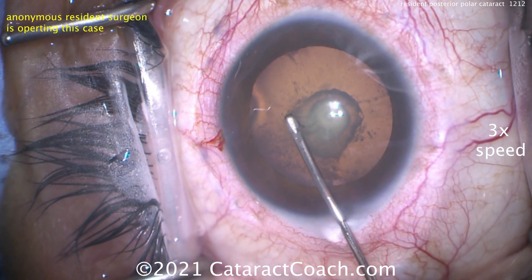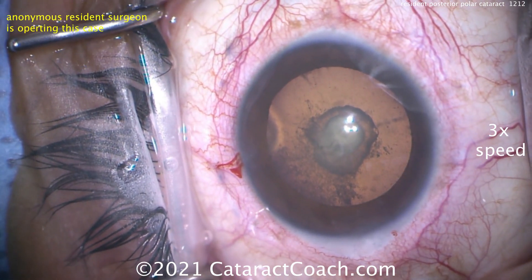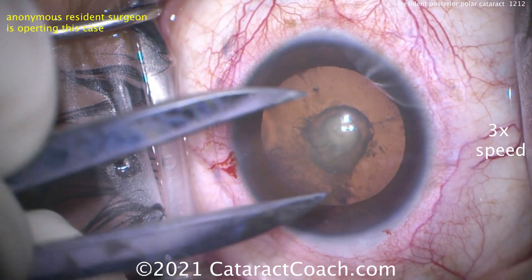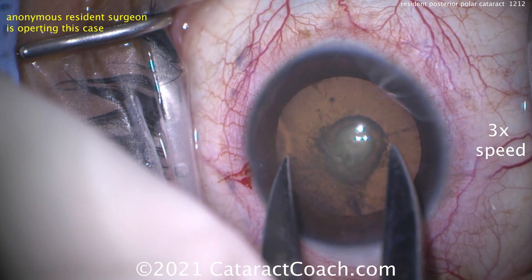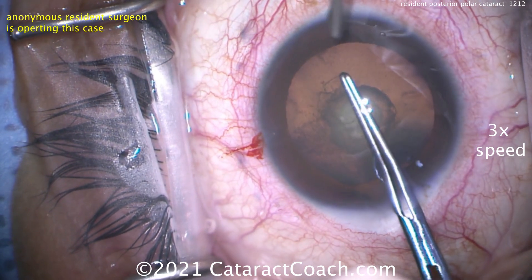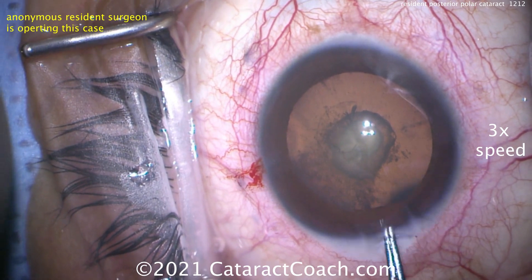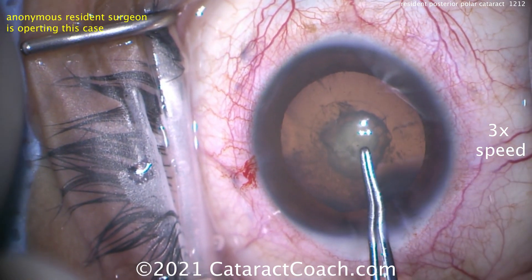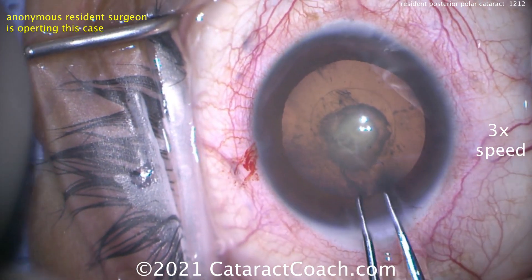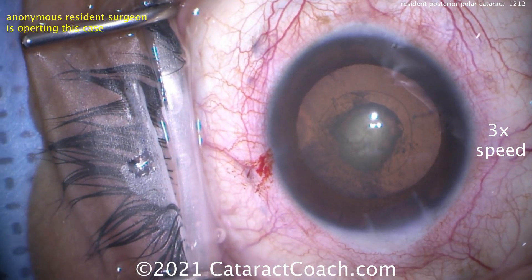In the studies published by Osher and Vasavada, we know that historically about one in three posterior polar cataract patients gets a rupture of the posterior capsule — that's huge. So we're marking with calipers to get an idea. If you mark 5.5mm on the cornea, due to magnification effects that's going to be about 5mm on the lens capsule. We want a nice, beautiful 5mm capsulorhexis. That is so important, because there's a good chance we'll be putting in a sulcus lens, and I want that support so I can get optic capture done. The rhexis looks great.